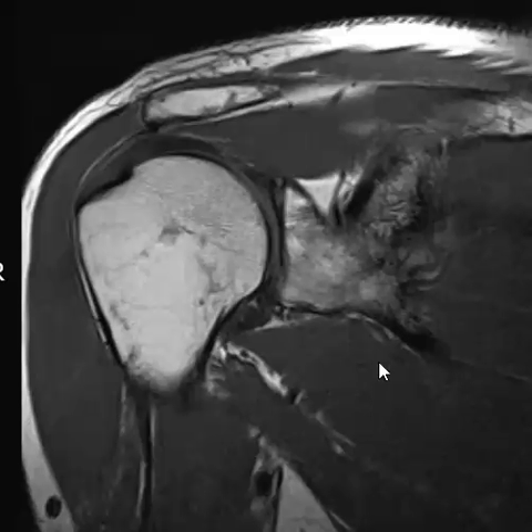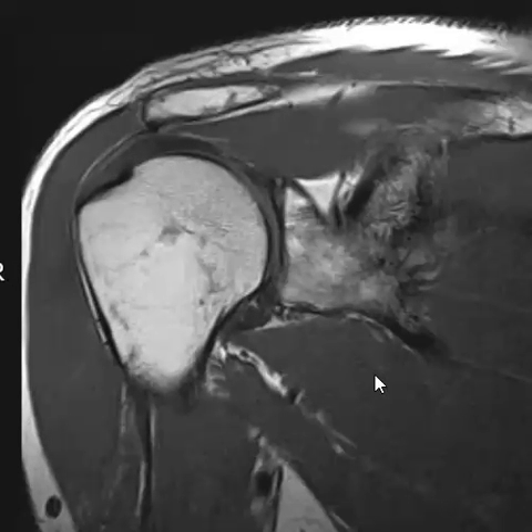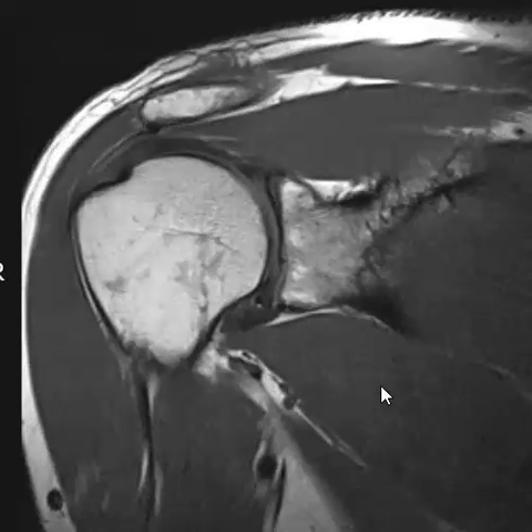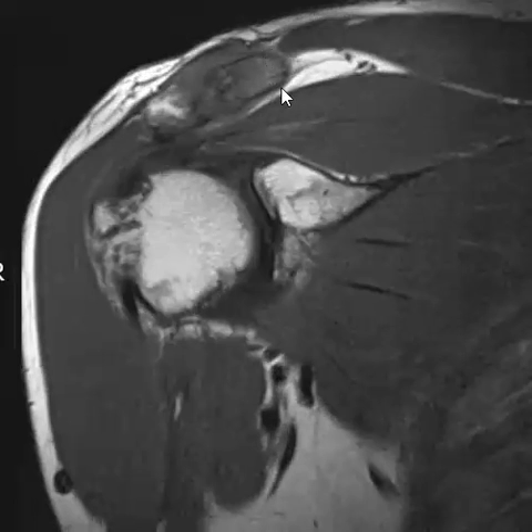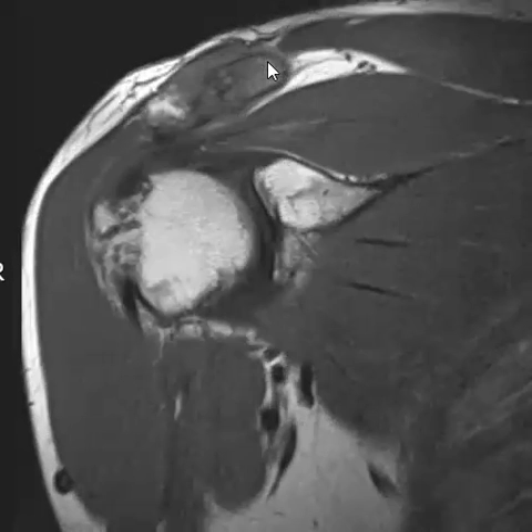Hello, this is Dr. Gay from First Look MRI. This is a 58-year-old male with shoulder pain; there's no history of prior injury. On this examination, we see almost a normal shoulder joint — the biceps and labrum things look pretty good — but the main problem was above the shoulder joint: the AC joint was abnormal.